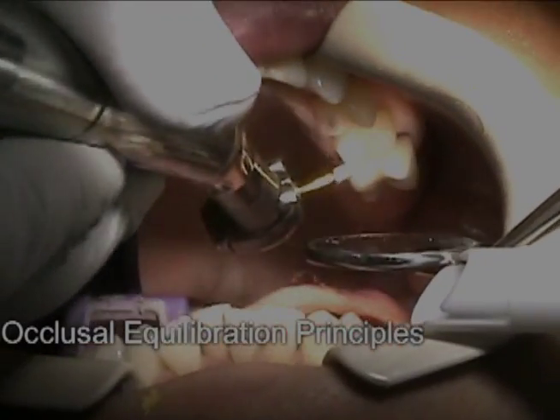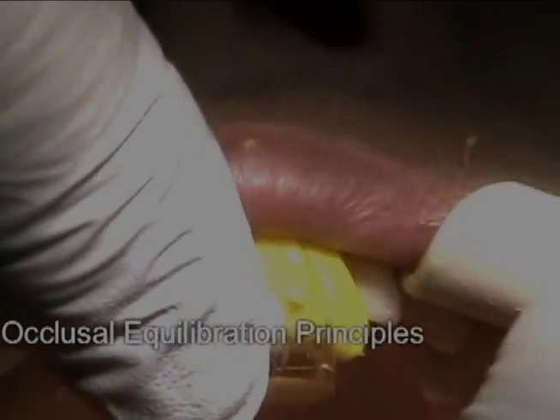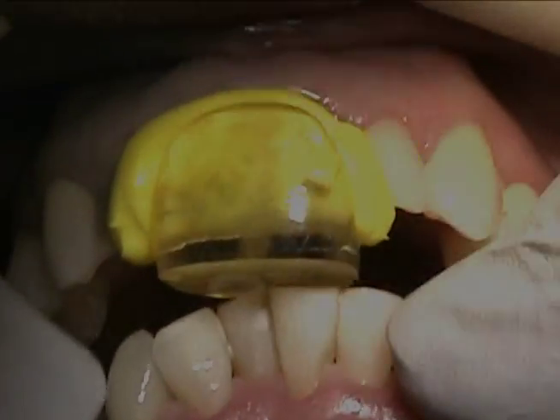Bring this in a little closer. Now touch together, bring your jaw down, and then just rest to your back, good. Let me take your jaw — there you go. Now slide forward.